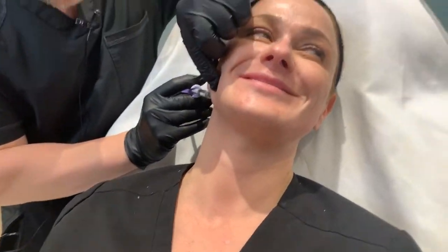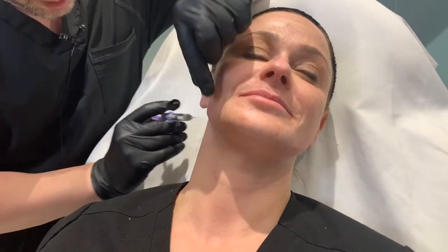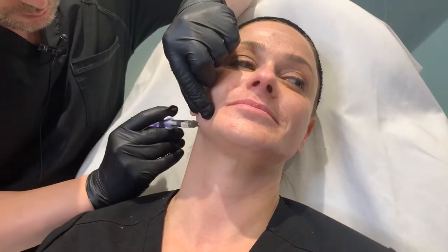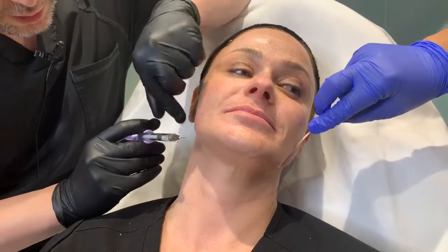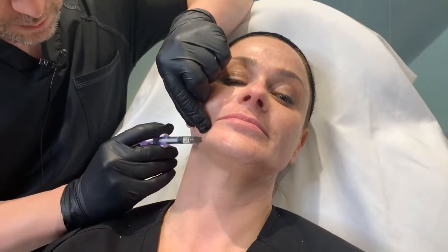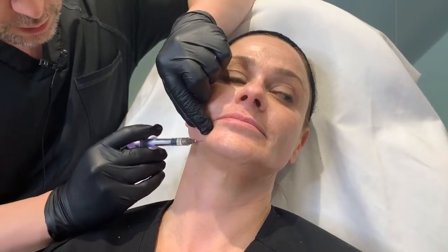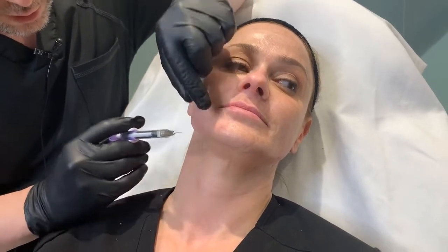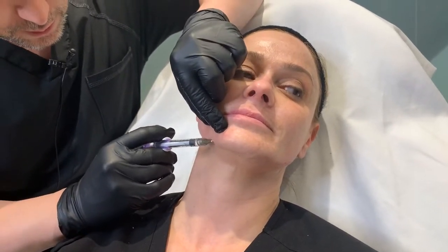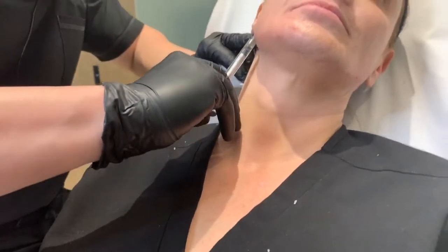So we're doing nice little bits all on the jaw. Remember I said, we're just blending here, just blending. And this area is a little more full, so we don't do as much there. We're gonna come towards the chin. With her, because her skin's softer, we wanna be a little conservative with the threads, very small threads. Perfect. All along there. And again, at that 90-degree angle.